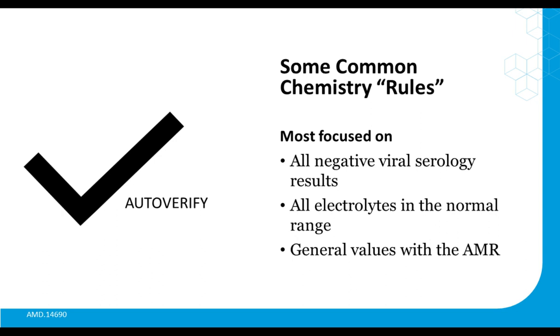is really not contemporary. For example, all negative serology results coming off an immunoassay analyzer, or all electrolytes that are in the normal range, those are typically automatically auto-verified in today's chemistry world because there are controls set in place, there are value checks set in place, whereas a human adds no extra additional value. Human inspection in the molecular laboratory, usually via paper printouts, has been the norm. But it's been automated via middleware rules that can automatically apply validation criteria, verification criteria, and render a judgment.